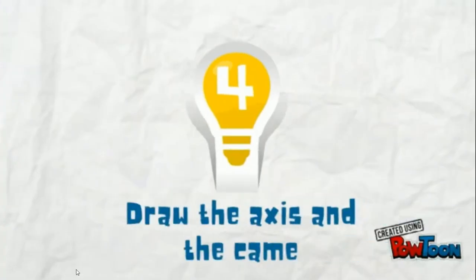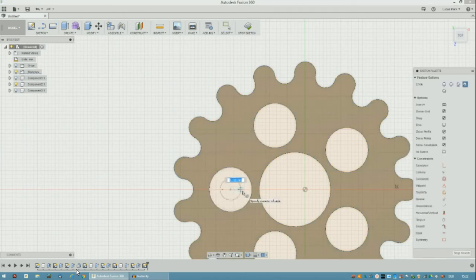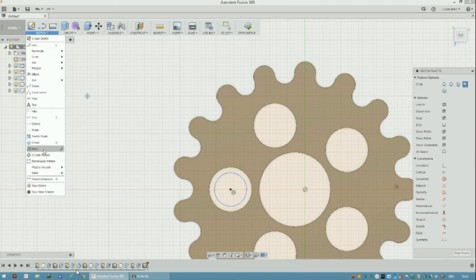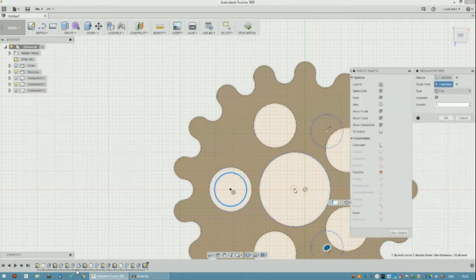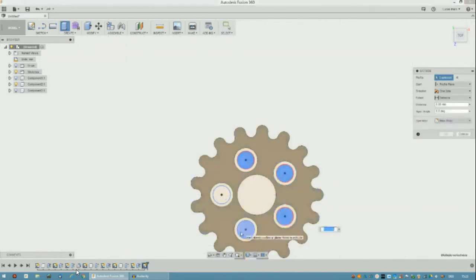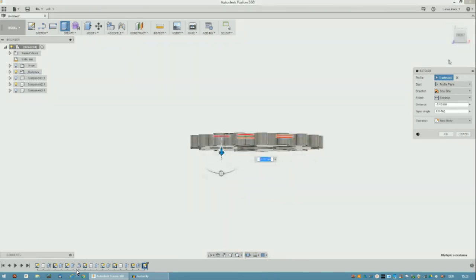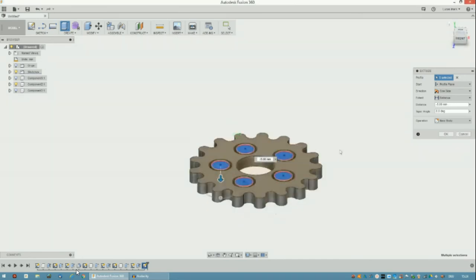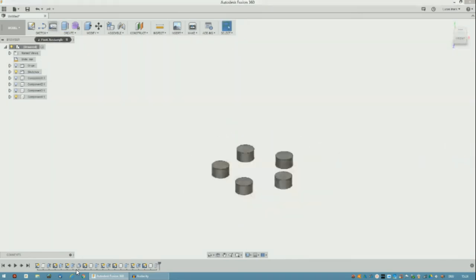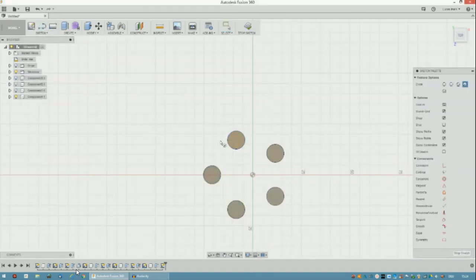Now it's time to draw the axis and the cam. Just drew a diameter of 9, I think, so that we have enough wobble, or 10 actually. And also pattern it around 5 times. Extrude it a little bit less than the thickness of the disc so that it doesn't scrub the other surface. Now we simply add our material, our disc to it.